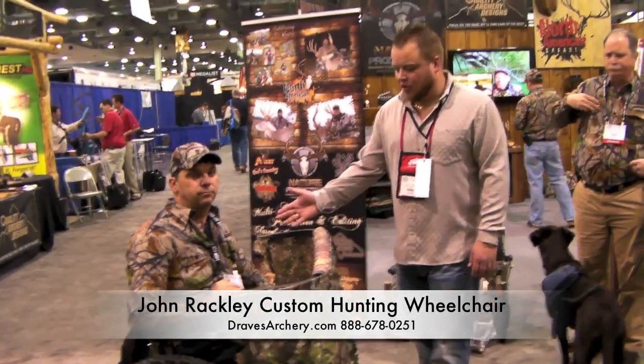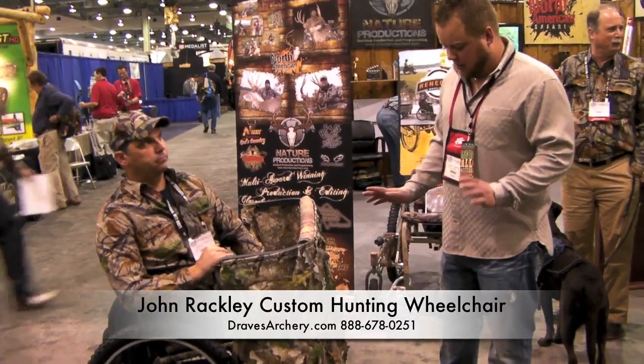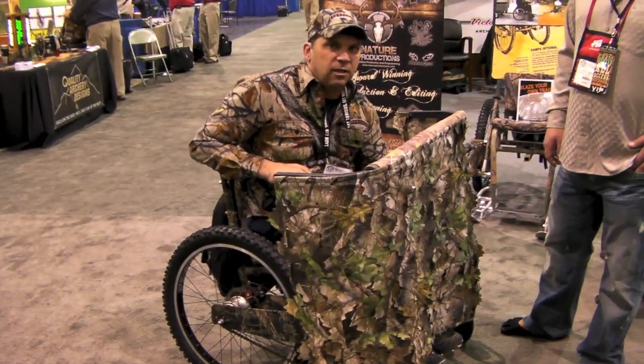At the ATA show with John Rackley, he's the designer of this great machine here. Why don't you explain it to us? This chair — I designed it because I live in Maine. I love hunting.